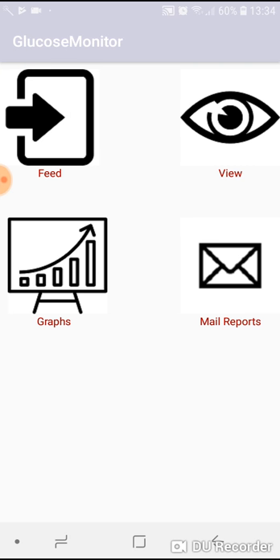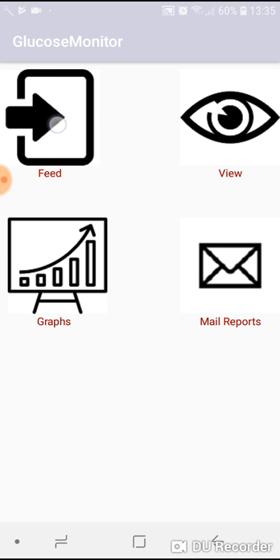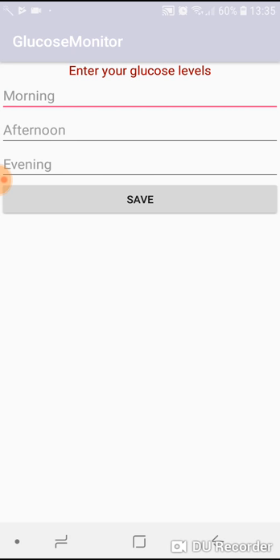Upon pressing this icon you can see four buttons: feed, view graphs, and mail reports. Feed is for feeding your daily values, view graph shows your reports in a graphical representation, and mail reports is for mailing your reports in a CSV format to anyone.